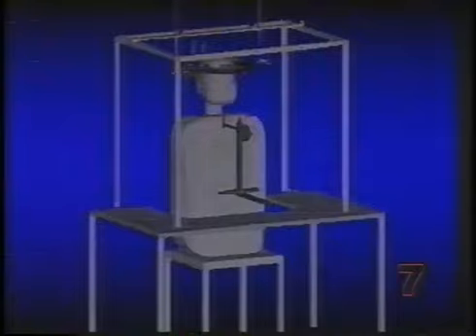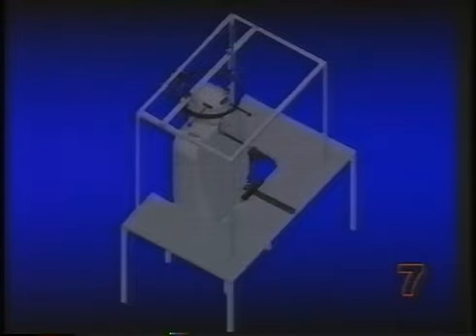In order to produce a truly reliable image, we need to know exactly where the transducer is relative to the head at all times. Therefore, we use this holder. The holder allows us to position the transducer in the sagittal or the coronal planes at any angle we like, and to be able to measure that position relative to various structures of the head.